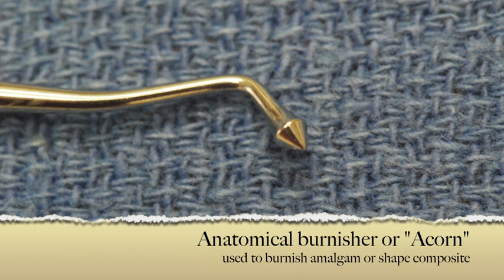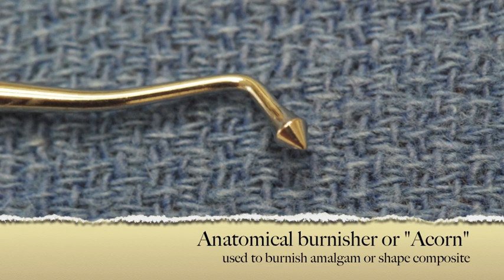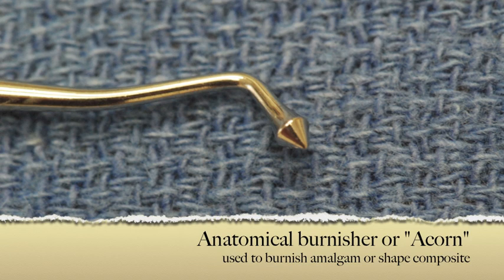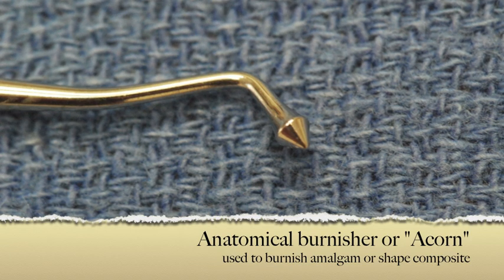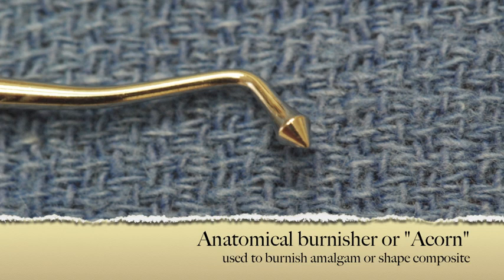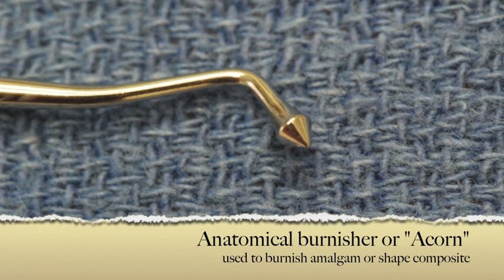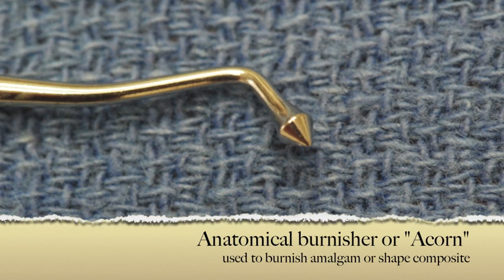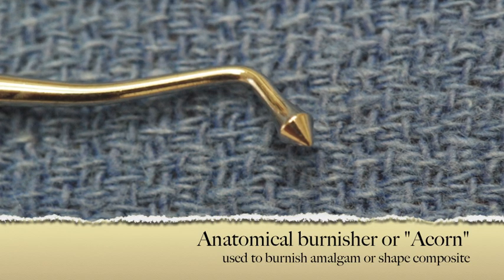The next several instruments as a group are called burnishers. To burnish means to rub, to cause a luster or shine. This particular instrument is called an anatomical burnisher, also called an acorn. This is used to smooth and shape, but it's also used to burnish, and with composites it can be used to contour or shape the composite prior to curing.